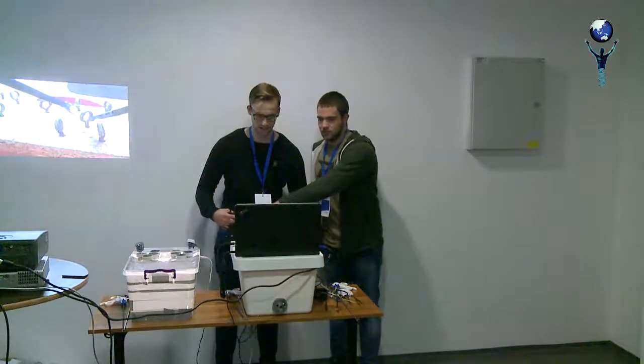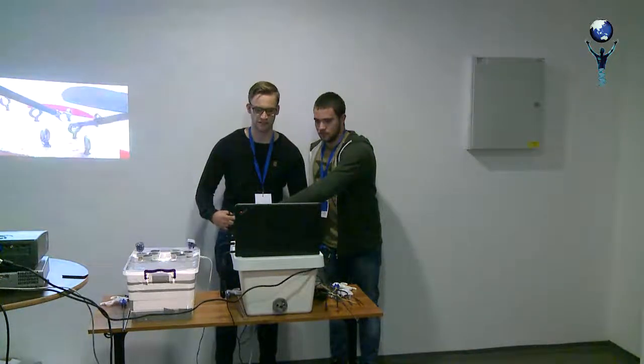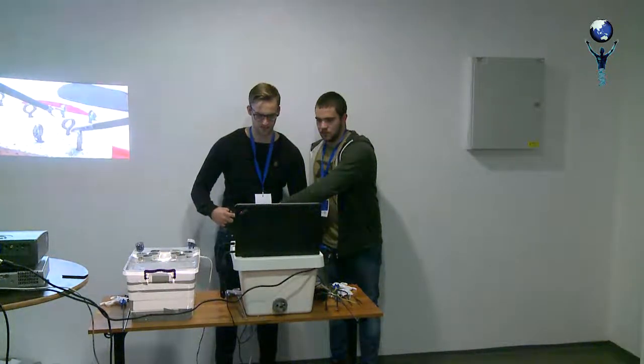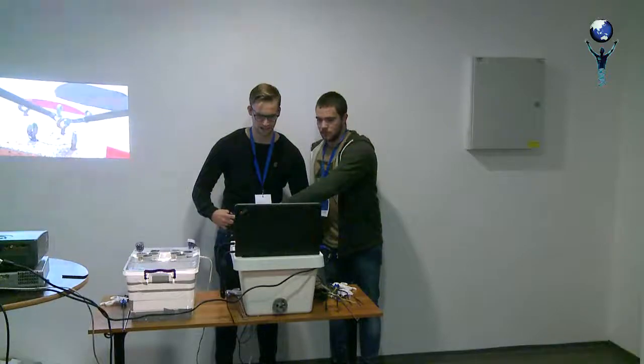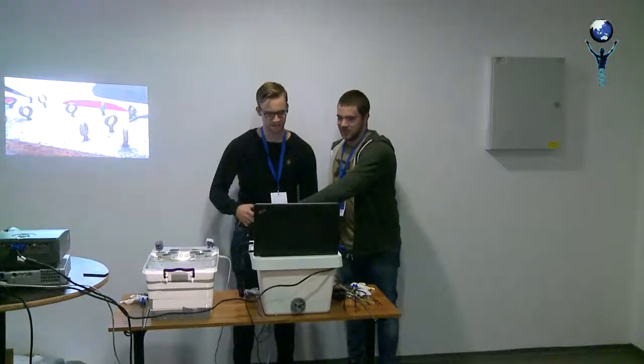The problem with robots is they are not cost effective, and the operative time is longer than laparoscopic and conventional approach because they have a docking time. Docking time is to change the instruments in the robot arm.